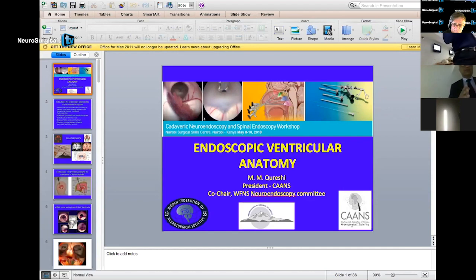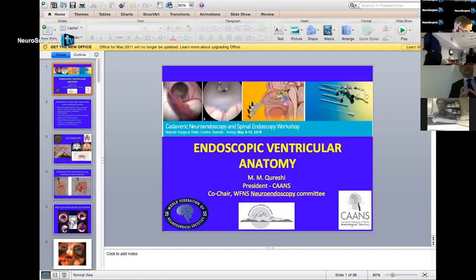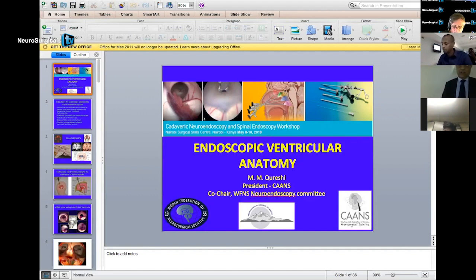The essence of today's endeavor for those who will come will be to focus on getting proficient at endoscopic third ventriculostomy and septostomy. Obviously, when you're in the ventricle, there is need to do a biopsy, there is need to do other procedures, but for this course, the emphasis will be on that, and there are models that are very nice that have been brought by Karl Storz, and we'll be dealing with that this afternoon. So we'll start off with endoscopic ventricular anatomy.